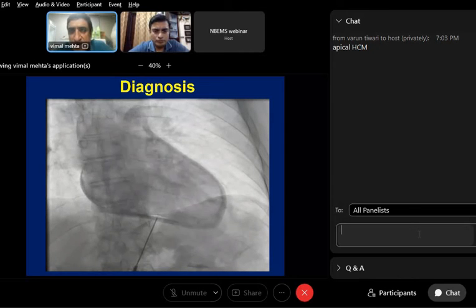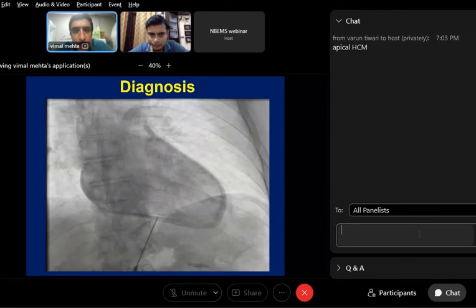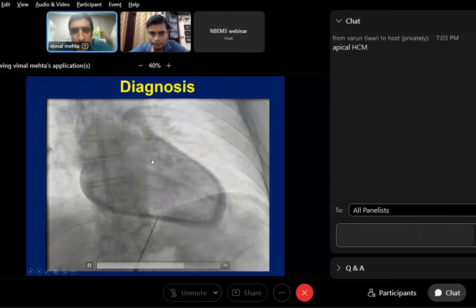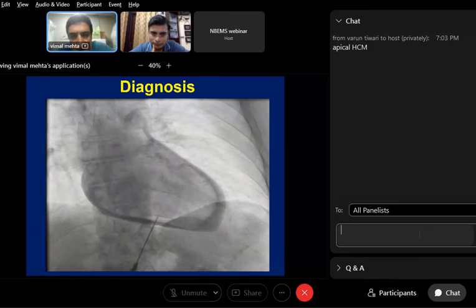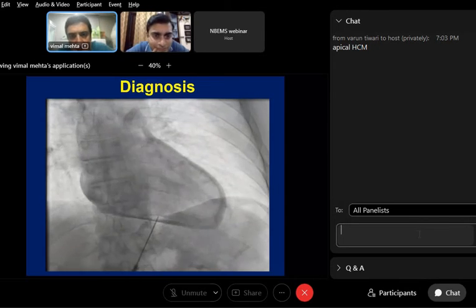Tell me all the findings quickly. Pericardiocentesis is being done. So the operator has taken a needle and wants to check whether he is on the right track or not. And he has injected a little bit of dye, which has opacified the whole thing. What all can you see? Tell me quickly why the procedure was done. Which artery was tackled? I want to know what procedure resulted in this catastrophe that we have to do this kind of thing.